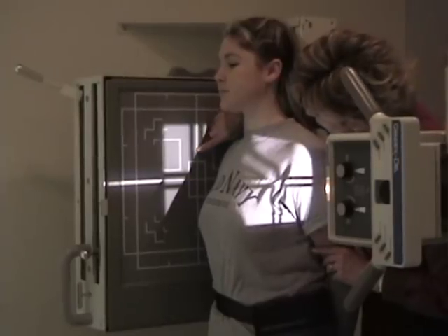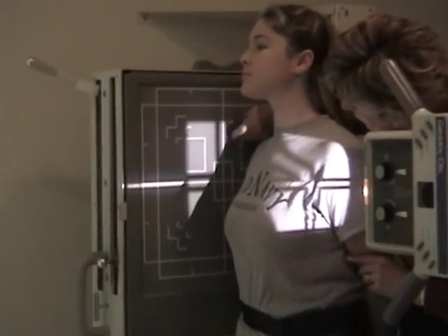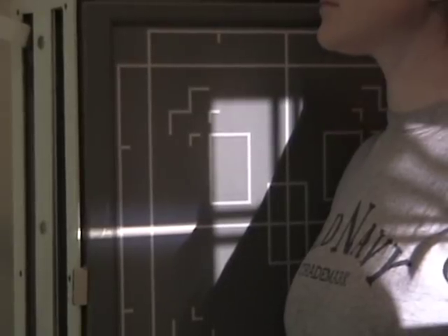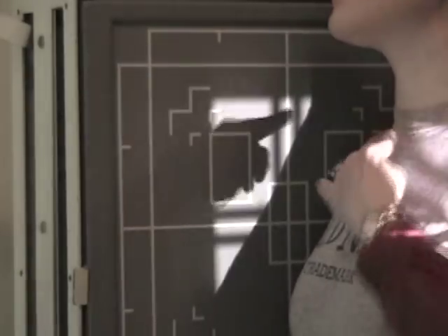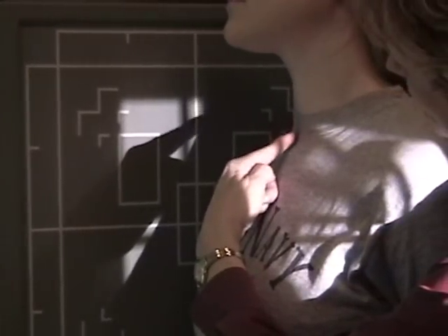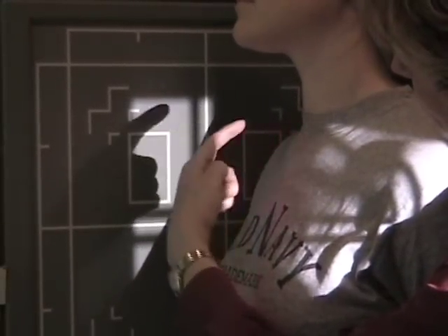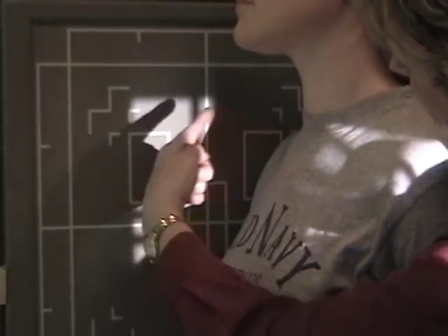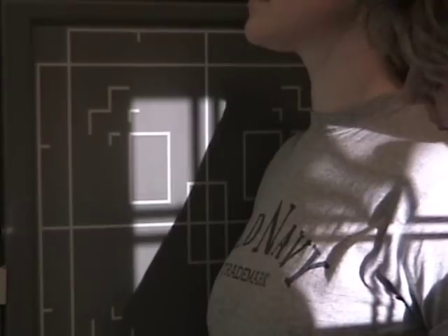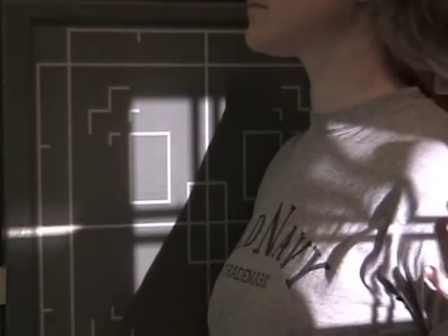Let's have the camera focus on the board here again. And this is the center of your film. And here's her, I'm trying to work backwards without choking you. Here's her manubrial notch right here. And see how I'm evaluating it, and I want it to be a little bit back of the center of the film because the xiphoid process will be to the front.